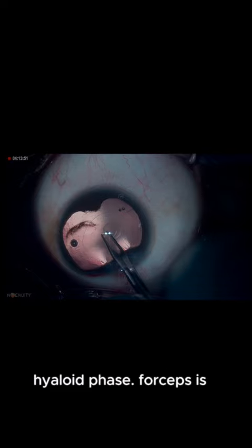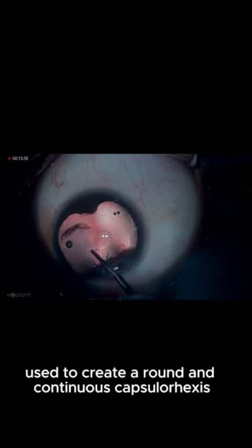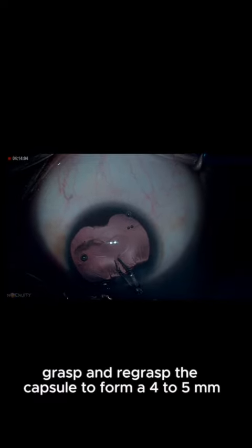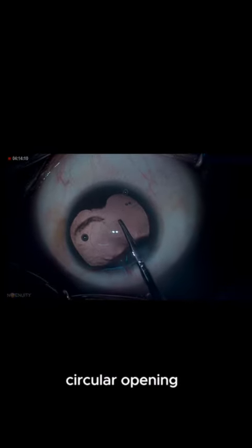Forceps is used to create a round and continuous capsular opening. Grasp and re-grasp the capsule to form a 4-5 mm circular opening.